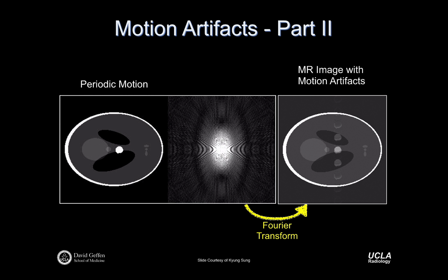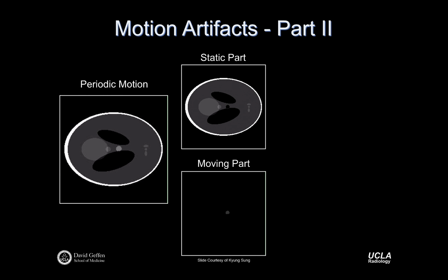And so when we take the 2D-FT of this acquired k-space with this pulsatile artifact, what we end up seeing is something centrally that looks mostly like the thing we care about, mostly bright, like the vessel itself. But then also, again in the phase-encode direction, you'll see these periodic replicants of the underlying vessel itself. And this can happen for many vessels, so it just depends on what the specific anatomy is. So let's pull this one apart and see what's happening.